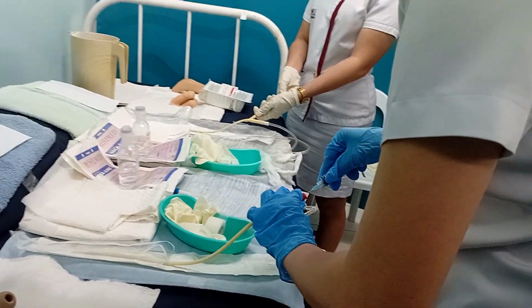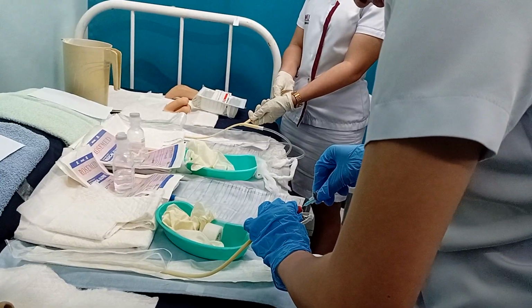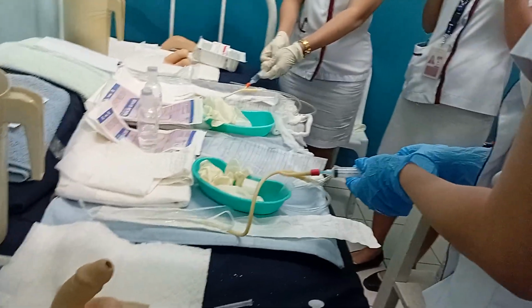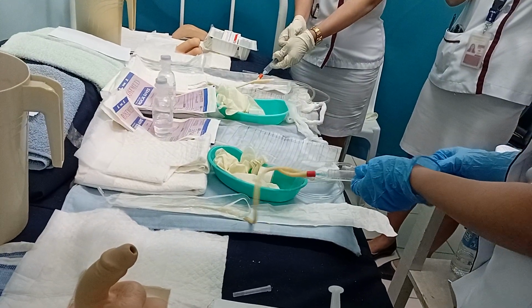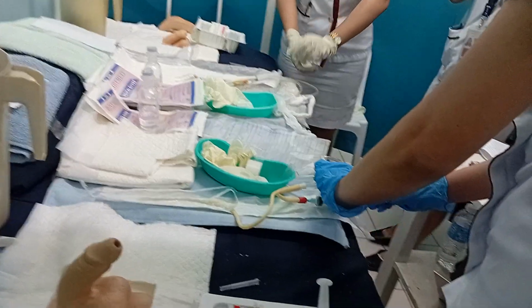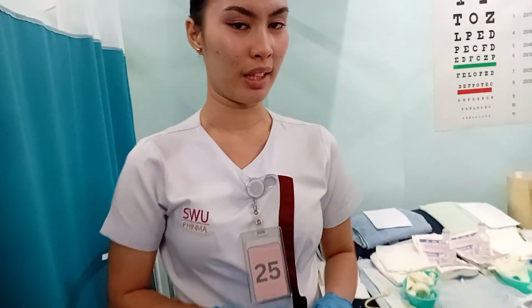So do not force, because it means you are in the wrong area. Okay, stop. Pause. So successfully, we're going to withdraw. This is successfully completed. Now you will withdraw and then leave it there. Okay. Now what will you do? And then after, we are going to retract the female's labia to clean the meatus.